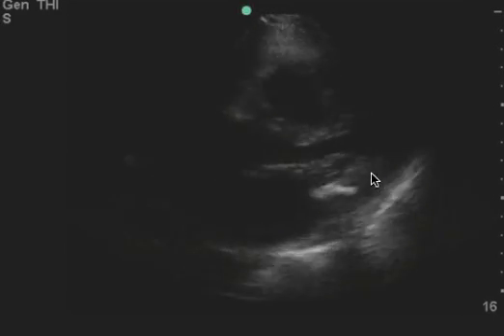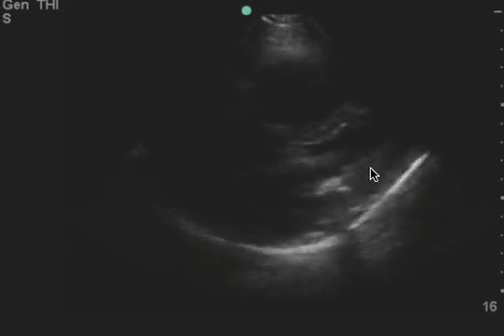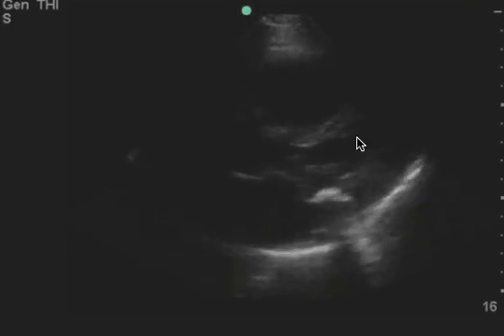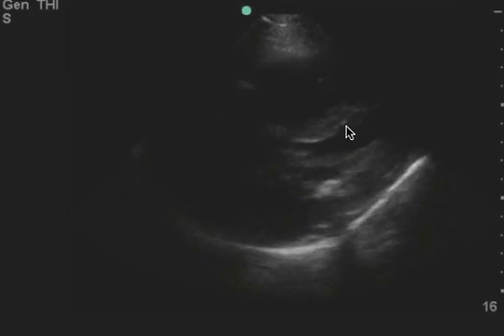This is a parasternal long view of a patient with shortness of breath. You can tell that the ejection fraction seems to be intact.